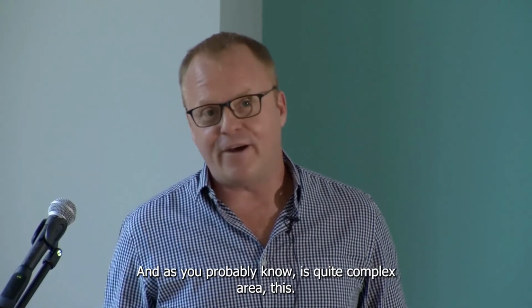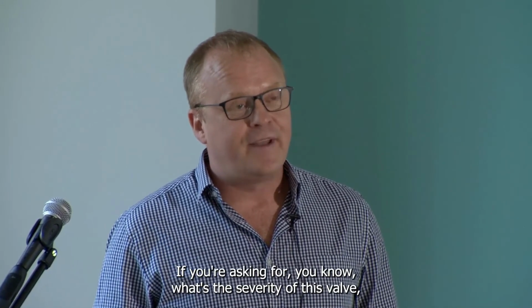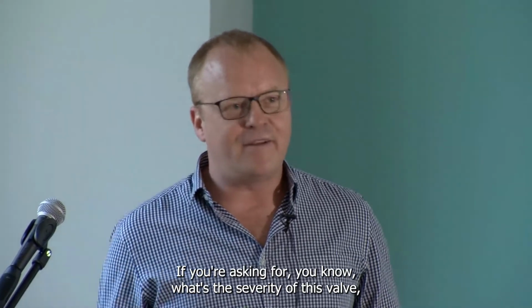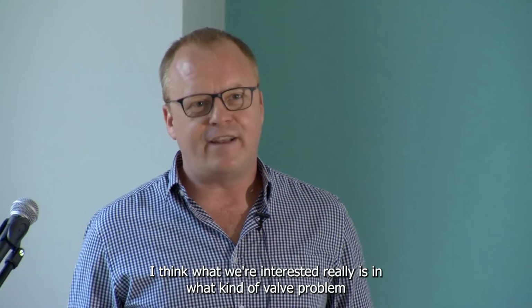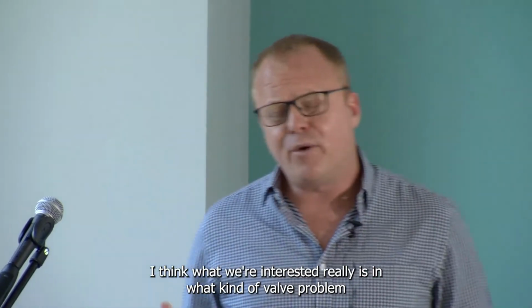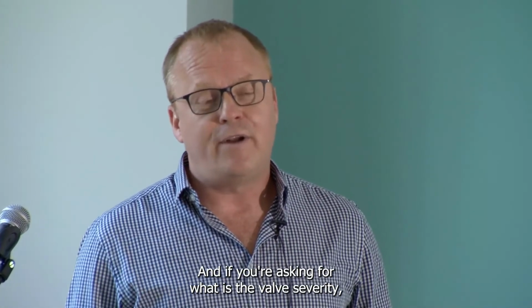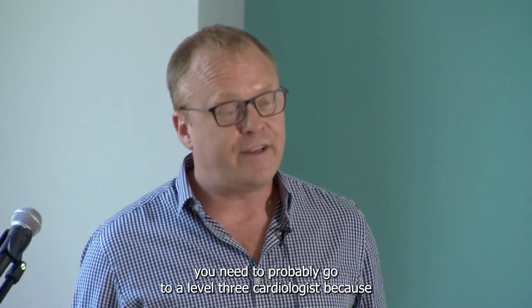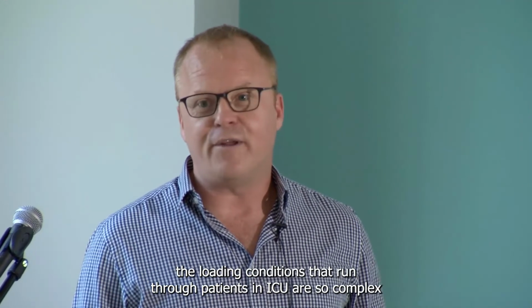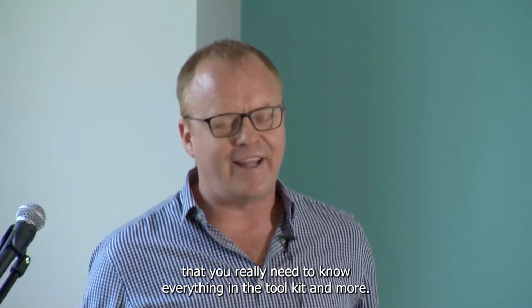And as you probably know, it's quite a complex area, this. And in fact, assessing valves in the intensive care unit, if you're asking what's the severity of this valve, you're probably asking the wrong question. I think what we're interested in really is what kind of valve problem might be impacting on hemodynamics right now. And if you're asking what is the valve severity, you need to probably go to a level 3 cardiologist because the loading conditions that run through patients in ICU are so complex that you really need to know everything in the toolkit and more.